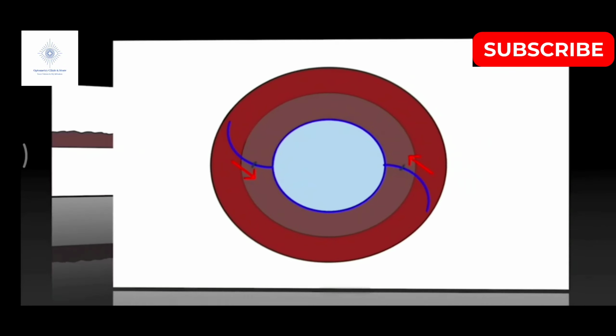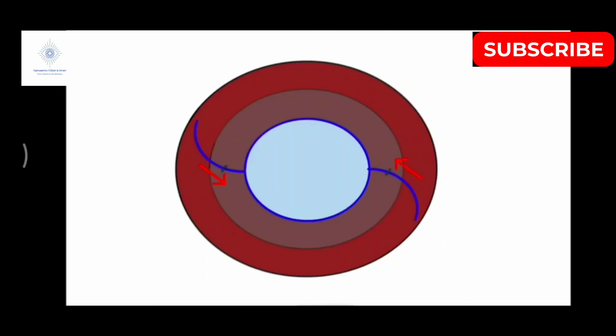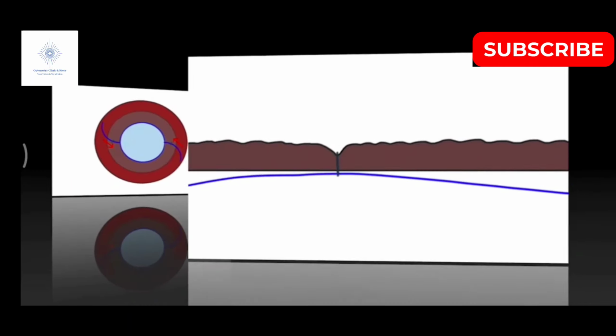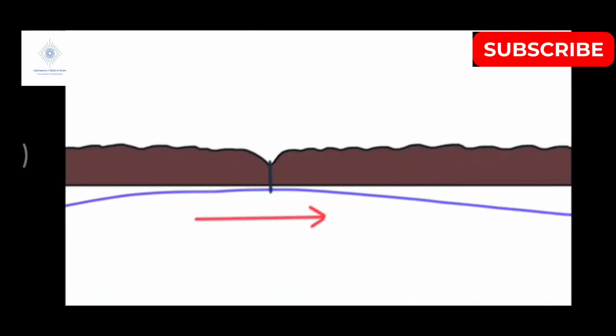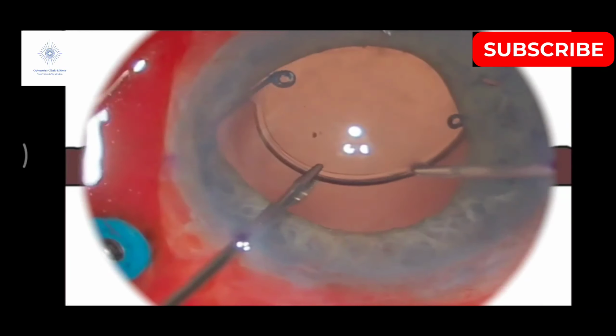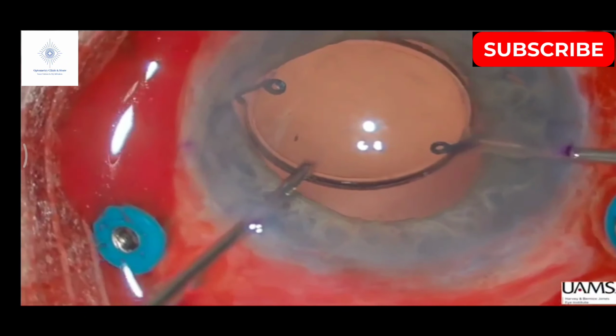Recognize that the haptics are held by suture loops, and the lens may be freed from the eye by pulling on these haptics in a way that frees them from the suture loop without inducing further iris trauma. Here we see bimanual manipulation of the lens with intraocular forceps.